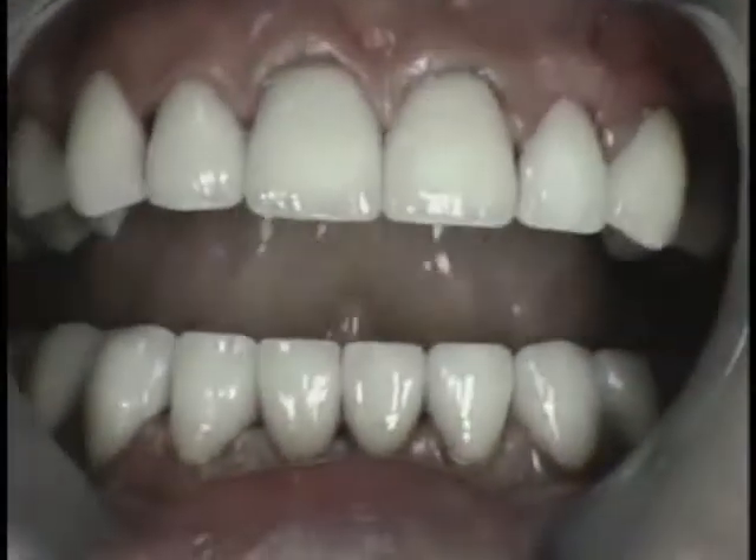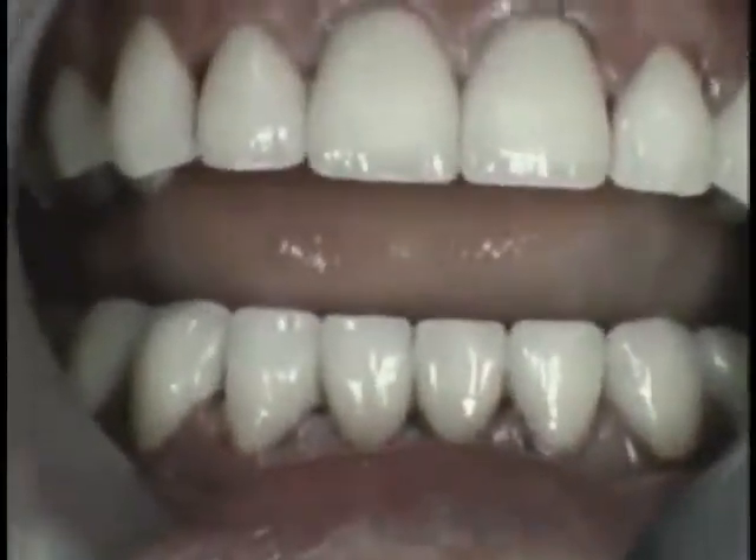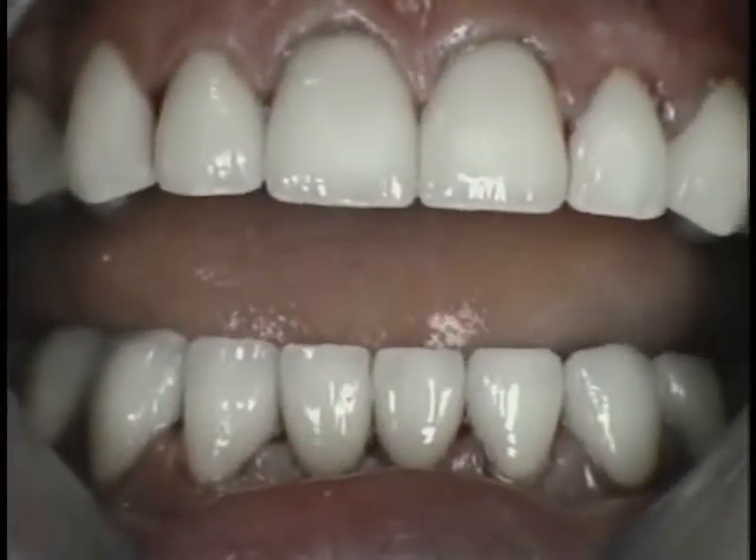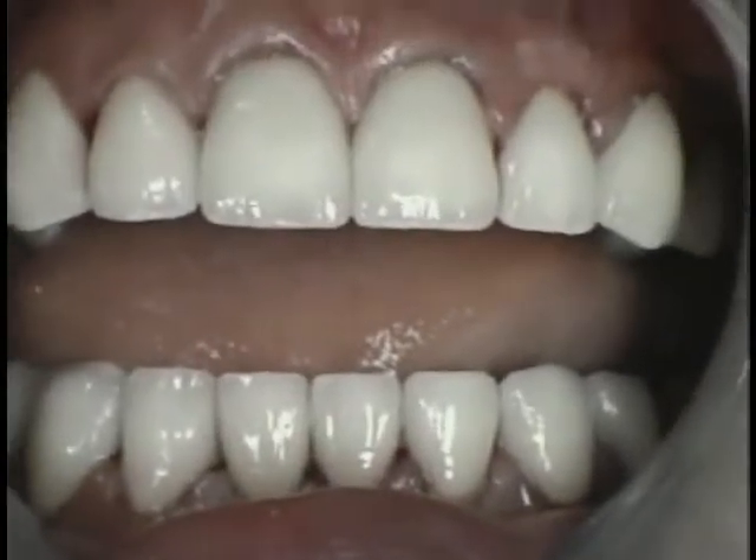Here you can see that immediately post-cementation the color is excellent and the tetracycline stains are completely hidden. The real test will come at the post-op visit in two to three weeks, when color stability is most critical.